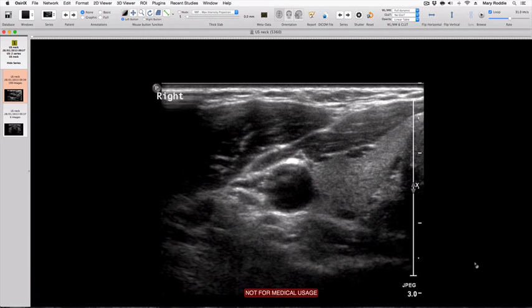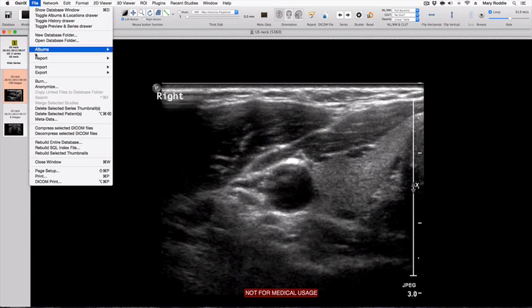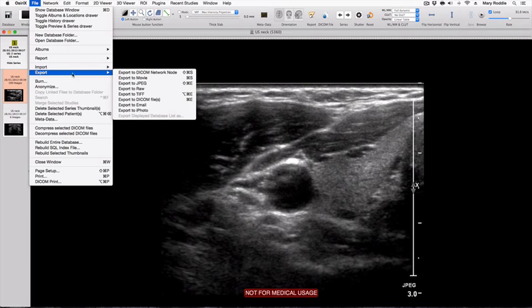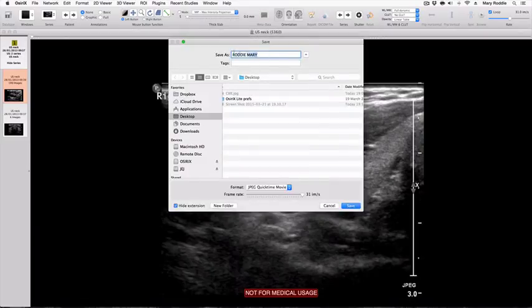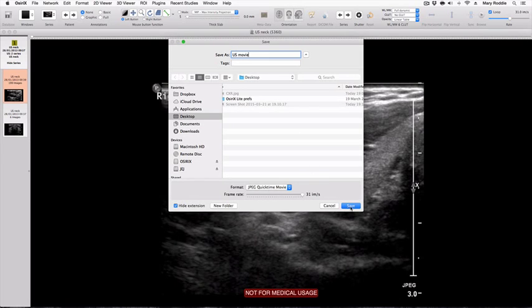The next thing I want to cover is exportation of a series of images as a movie file. If we look back at this case of 199 ultrasound images and export to movie, we press OK, call it 'ultrasound movie', and export it to the desktop as a QuickTime movie.